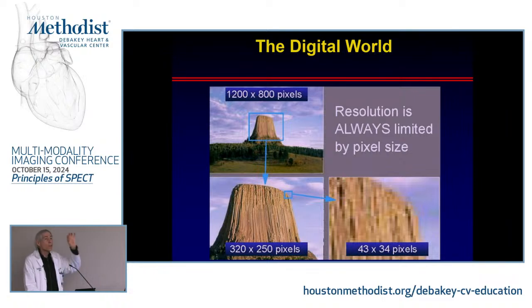Remember, all of these images have an intrinsic spatial resolution based on the dynamics or the construction of your imaging technique. But the image resolution that you see on your screen is also based on what you're actually looking at. And that's why in cardiac imaging, we like to get the best imaging equipment as possible that has the best image resolution, so we can appreciate and take the opportunity to see images more clearly.